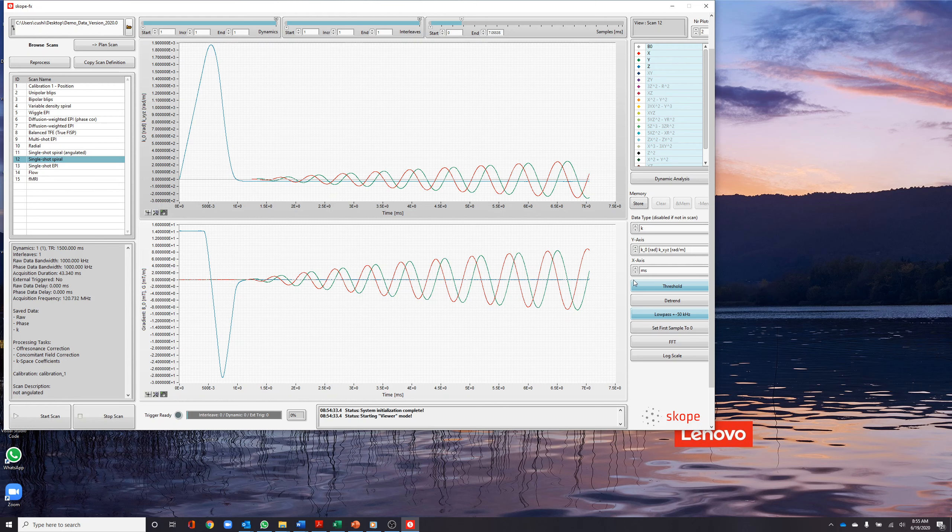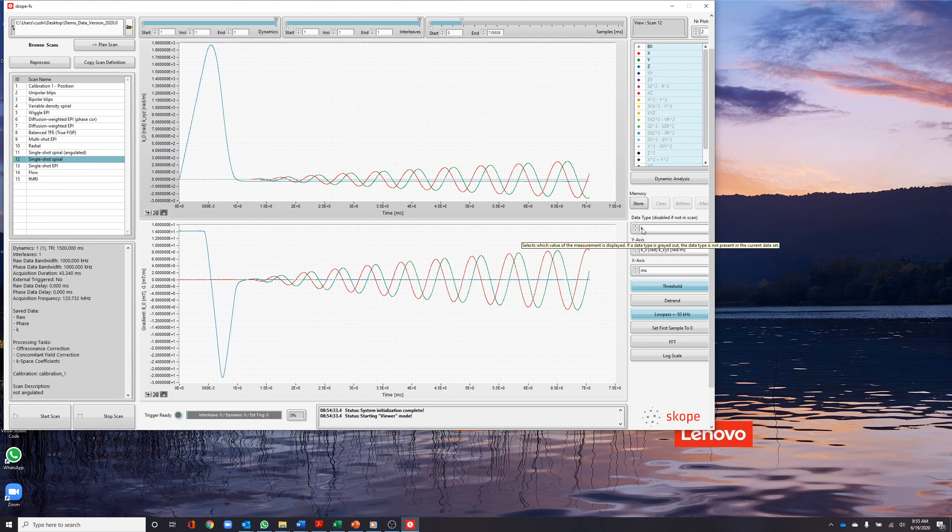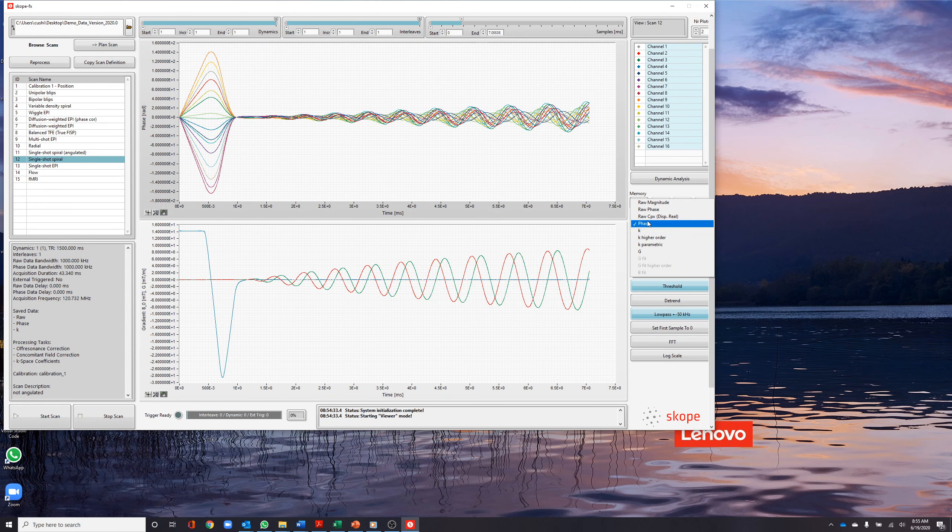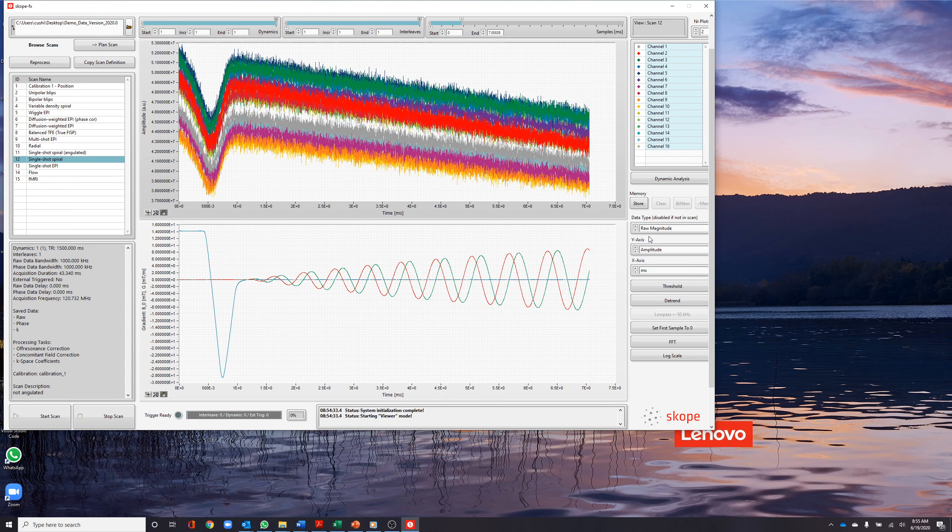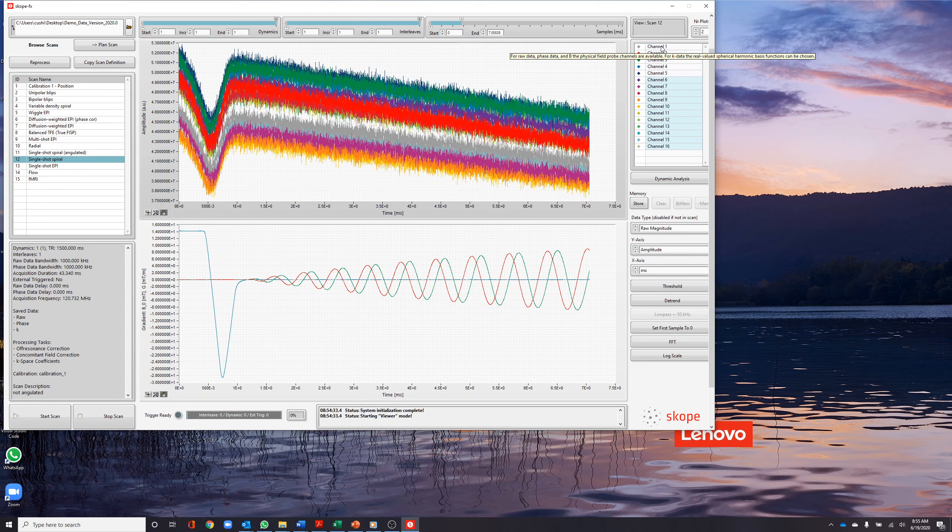To begin our investigation of the single-shot spiral, we select raw magnitude from the data type drop-down menu. This displays the amplitude of the free induction decay signal measured by probes.